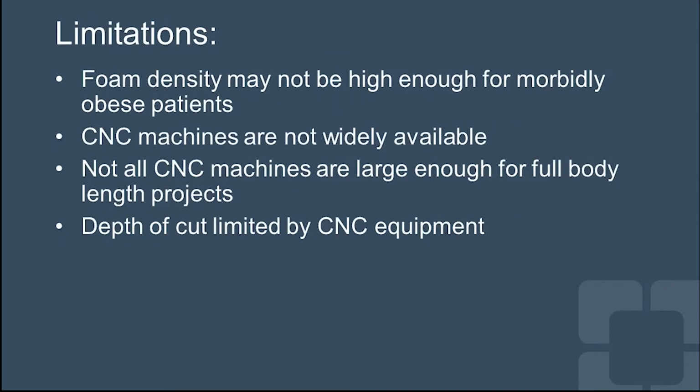With regards to limitations, the foam density may not be high enough to support the full weight of morbidly obese patients, which could be addressed with using different types of foam. The depth of cut is limited by the CNC machine equipment, including the shaft and router bit used. In this case, it was deep enough for a 3.5-inch cut. And finally, the CNC machines large enough to support the material height needed for foam projects such as this are not widely available for public use, but many research institutions do have these machines available for private use.